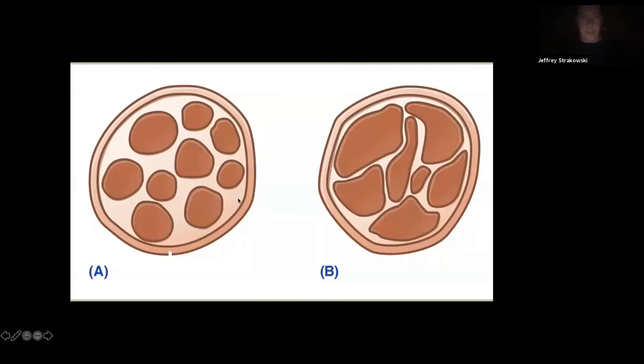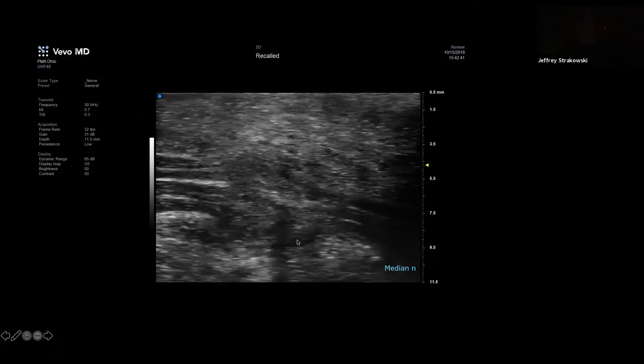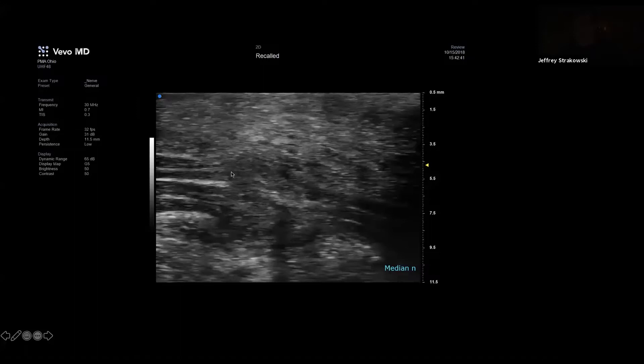A cartoon view of the internal components of the nerve shows changes we see with conventional ultrasound — a loss of the normal fascicular structure. At higher resolution it looks more like a significant change. We can look for nerve trauma and neuroma areas of enlargement. With ultra-high frequency at 48 megahertz, we can see the normal fascicles moving into an abnormal neuroma. We can tell the outer structure is still in continuity, but this is a very severe injury because there's complete loss of fascicular architecture. We can localize it down to millimeters — the entire screen here is 11 millimeters.